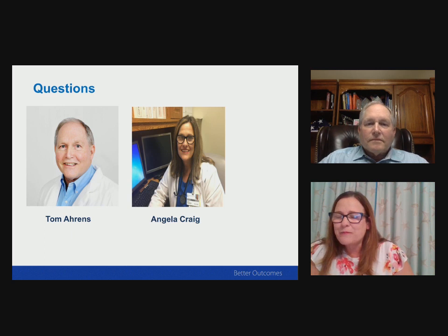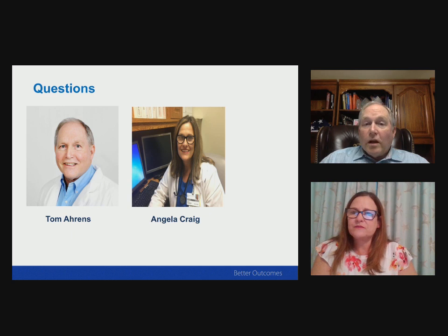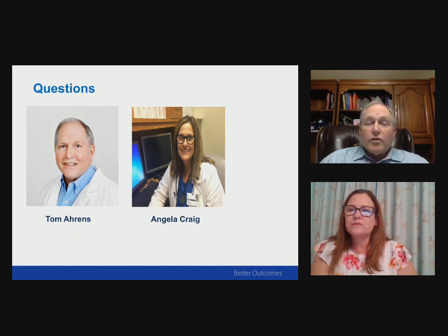What are your thoughts? Oh, I think it's a very valid question. You want to see a decent exhaled waveform. You may not see it as well simply because the person isn't breathing, and if you're ventilating them, you should be able to see the normal waveform. But the research that we've done and others have shown that the capnogram by itself is valuable, even if you don't see the waveform.